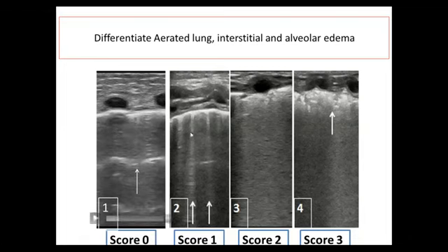And then when you have longitudinal B lines, 2 or more at least in one single image, give a score of 1. So this is representing interstitial fluid, and typically can be seen after birth in infants with TTN, or later on, for example, if you have preterm infants with PDA, and the PDA causing more interstitial fluid, it also can be seen in that condition.